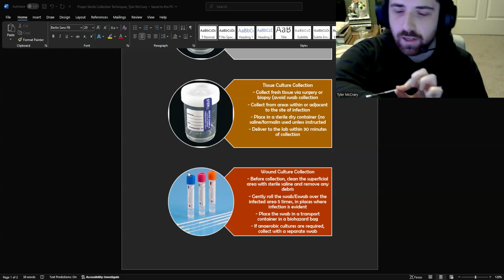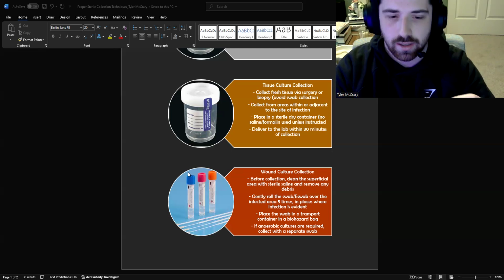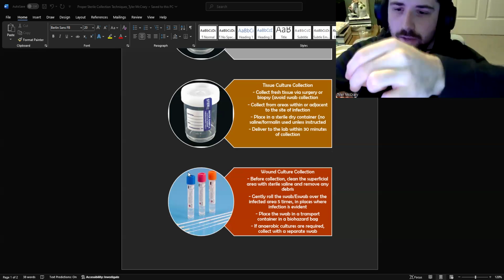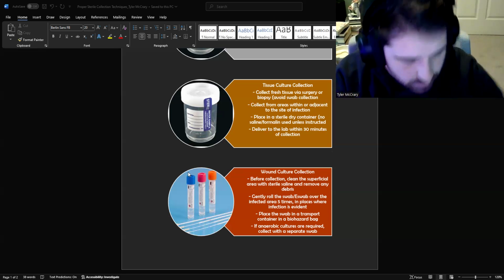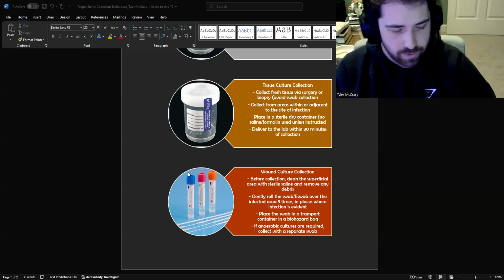You would swab the area of infection 5 times, as stated in the procedure. And then again, this one also has where you can break off. So you would stick the swab in the transport tube, break off the container, and then reseal it. And that keeps everything sterile and avoids any contamination in the micro lab.